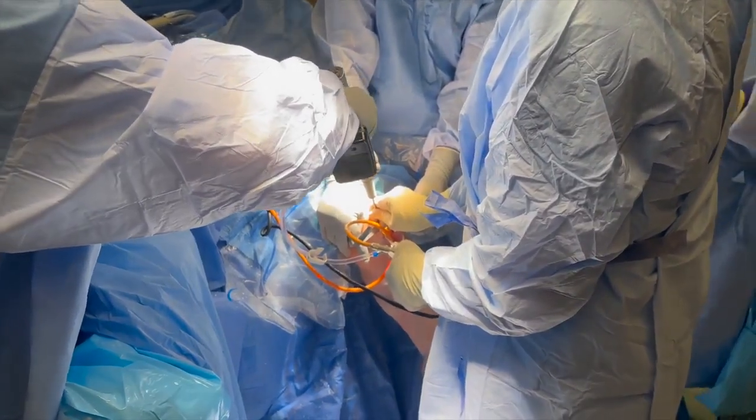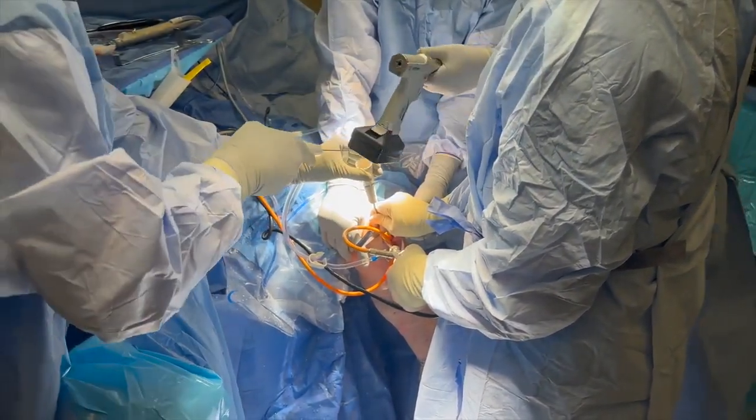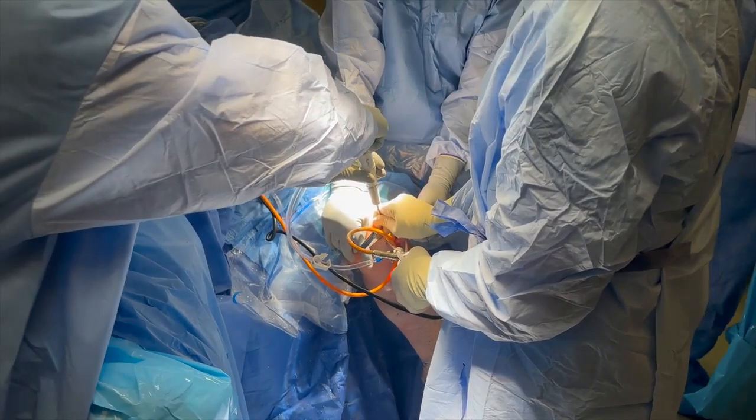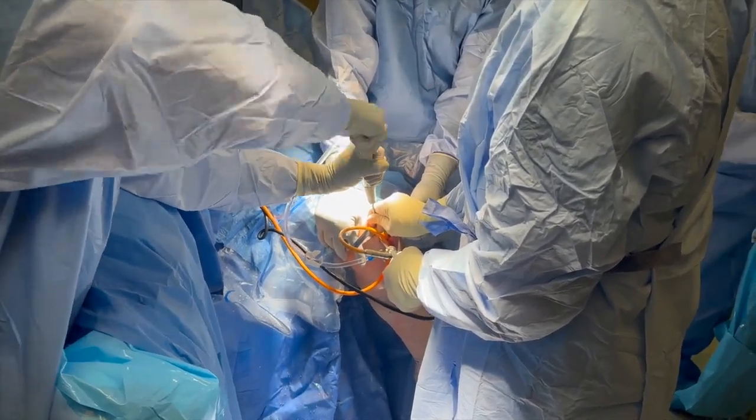Two double-loaded Q-fix anchors are placed on either side of the previous medial meniscus root repair where the bone was previously decorticated. Arthroscopy is used during anchor placement to ensure correct placement location.